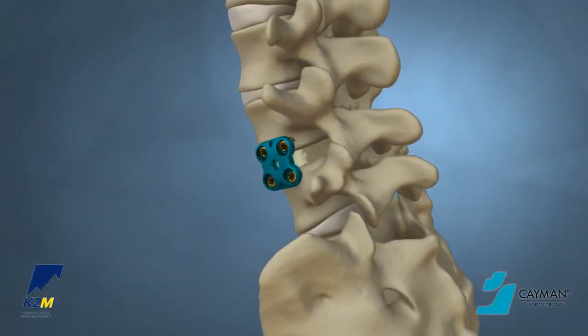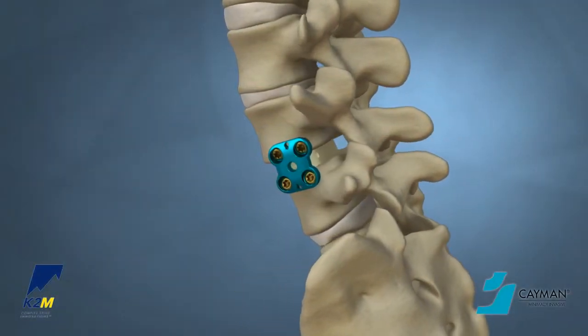This module demonstrates a 360-degree fusion through a single minimally invasive incision.